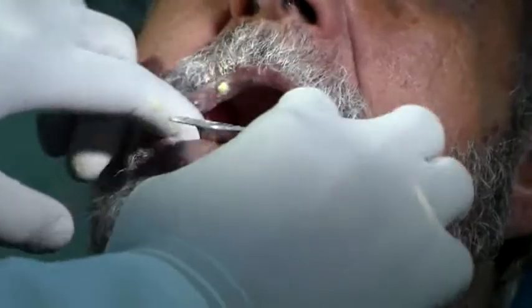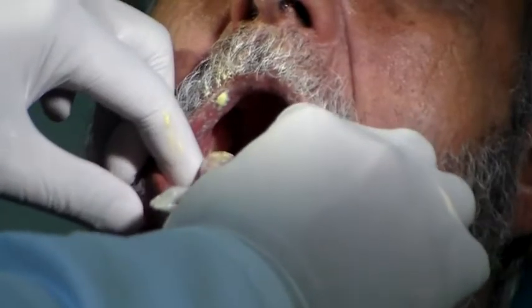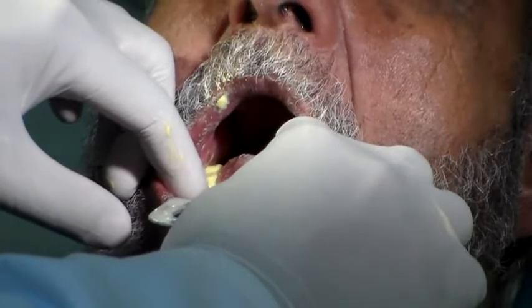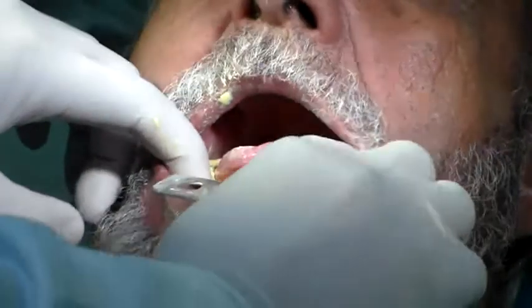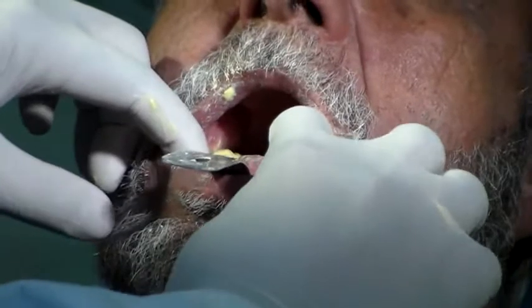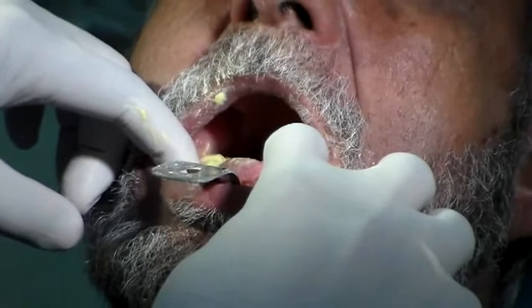So I'm going to wait for the material to set. You can see all my extensions are okay, and you have your impression.